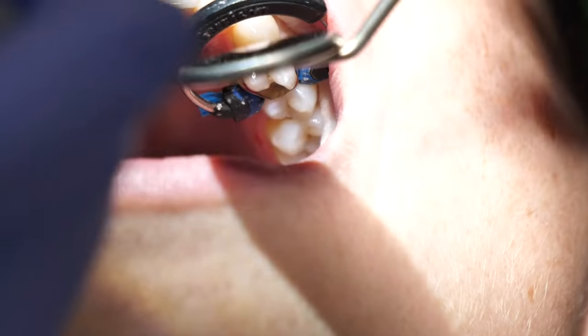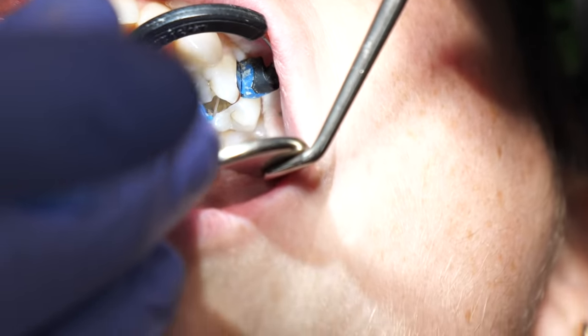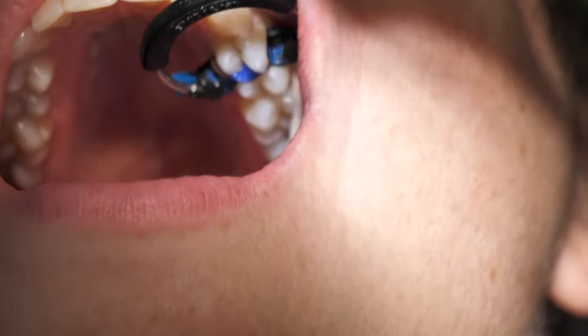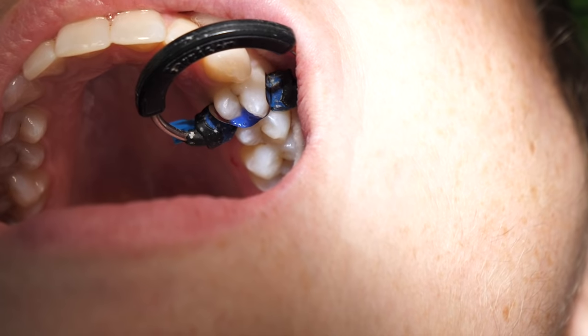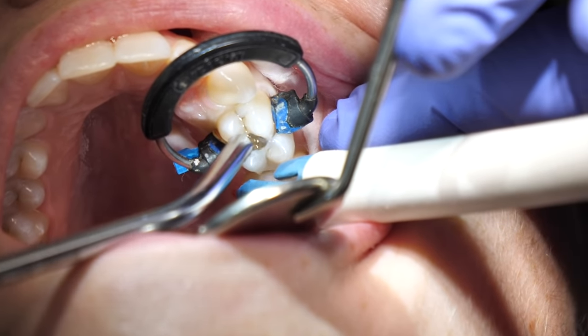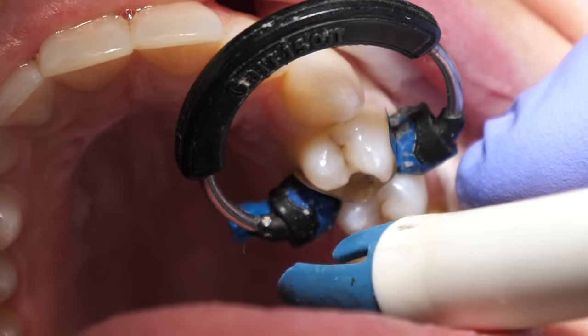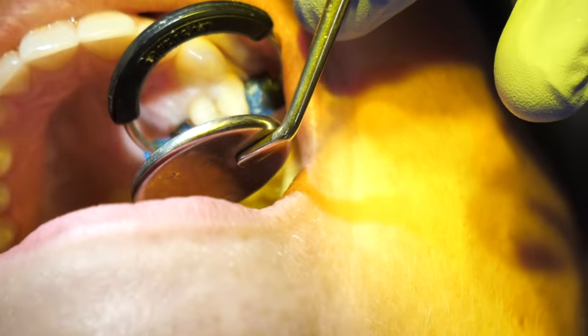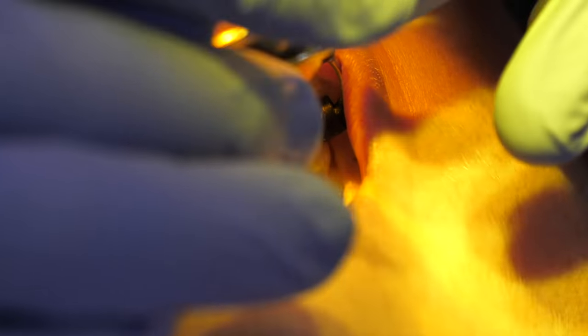and now they are ready for the filling process. The dentist will first place etch on the tooth. Etch is an acid gel, usually blue, and it's used to roughen up the surface of the enamel. Then the etch will be rinsed and suctioned and dried to prepare for the next step. So now you'll notice they have actually turned off the bright light because tooth-colored fillings are hardened by light.